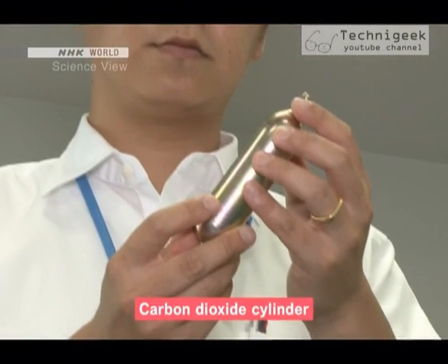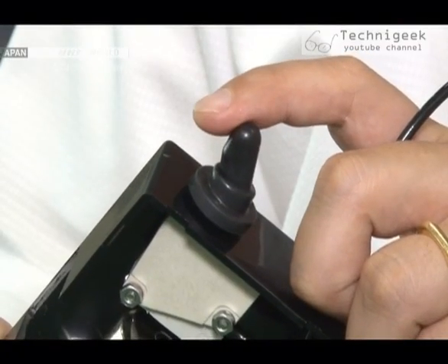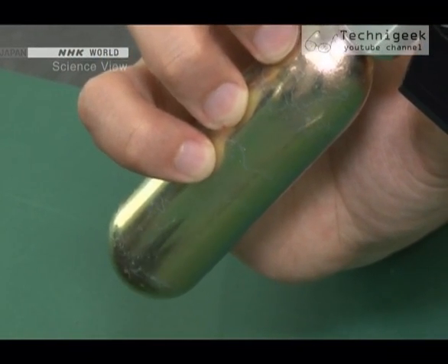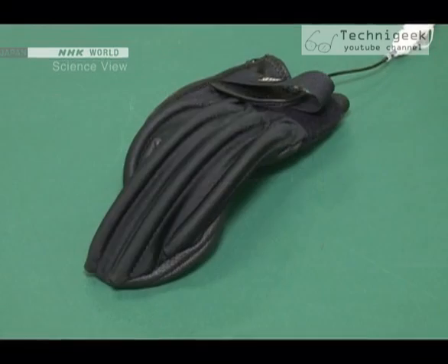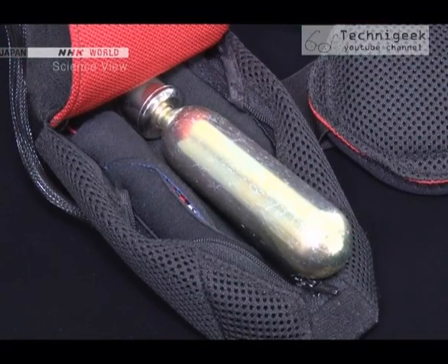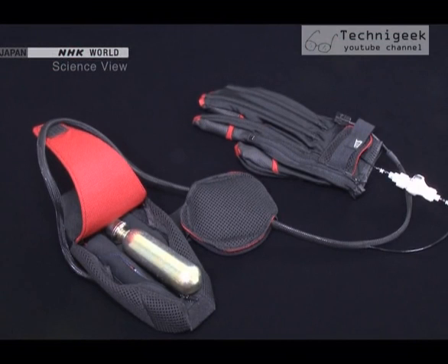After much trial and error, the Takumi came across a carbon dioxide cylinder. Carbon dioxide liquefies when compressed, so a large amount can be packed in a small cylinder. With just one cylinder, it can perform the gripping movement 100 times. This was how he succeeded in creating a simple, easy-to-use glove that provides gripping assistance and weighs only 500 grams.